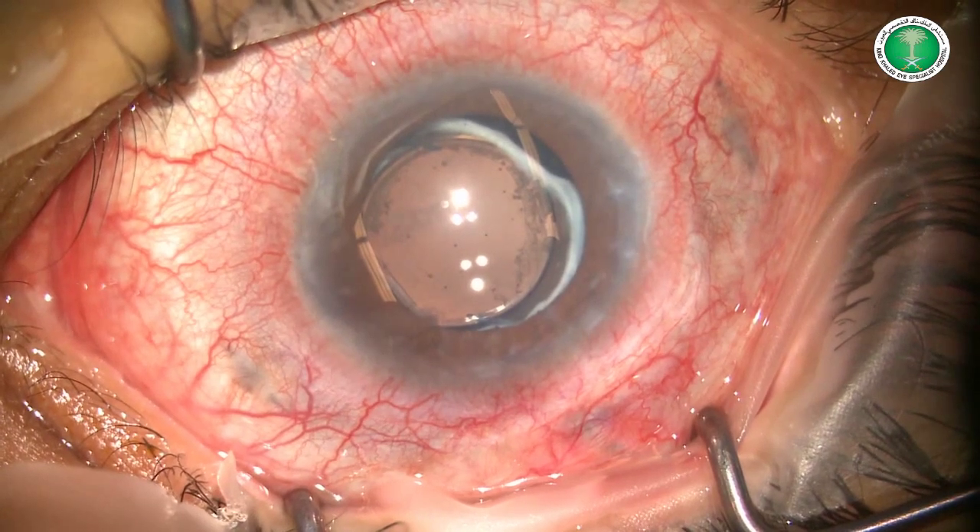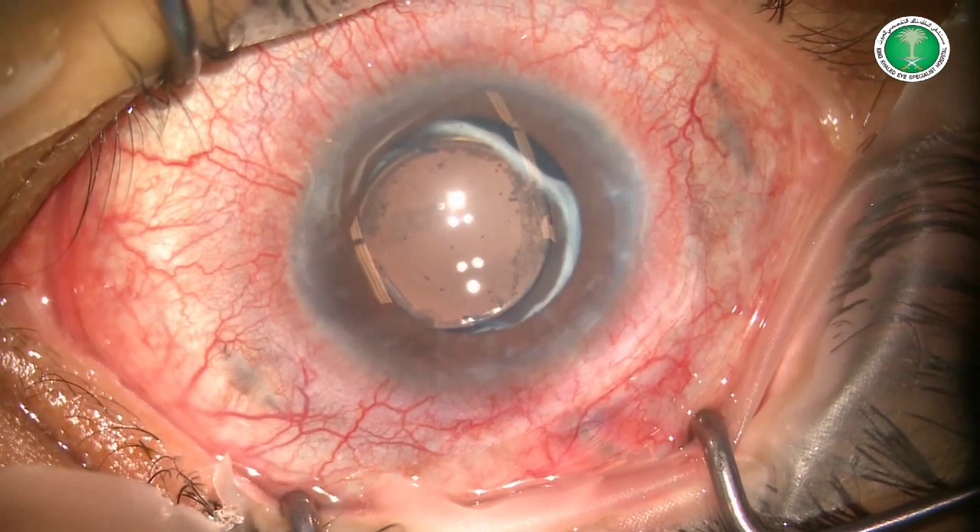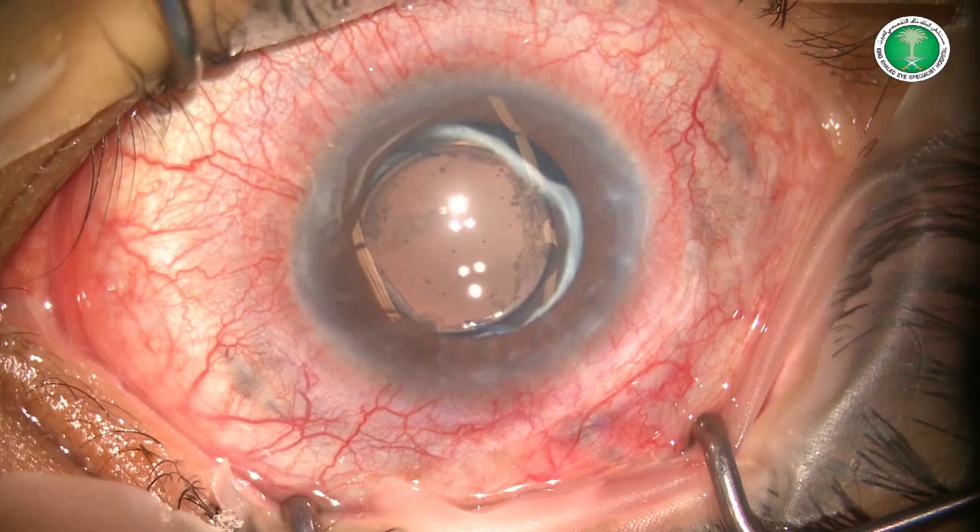The patient is pseudophakic and the tube was previously implanted in the ciliary sulcus, further away from the cornea.